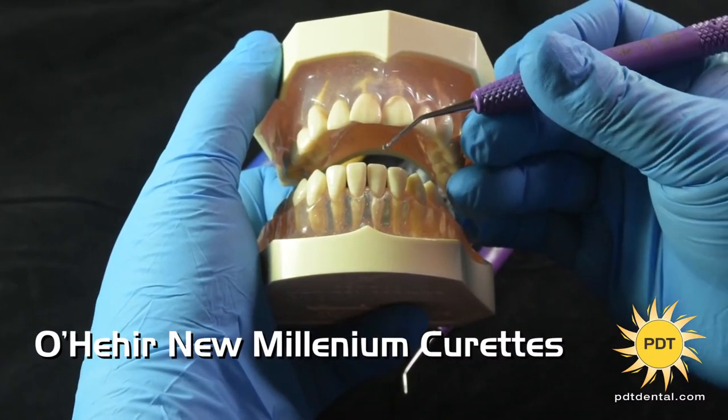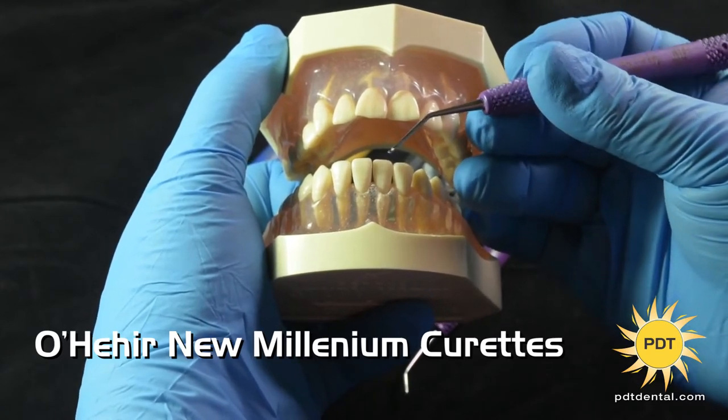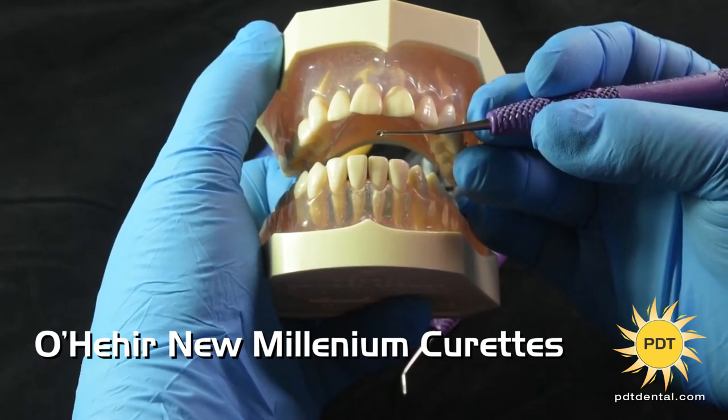Hi, I'm Wendy Bertels, RDH, and these are the O'Hehir New Millennium Curettes. They are available in multiple angulations, allowing you to choose the one most effective for calculus removal on your patient.